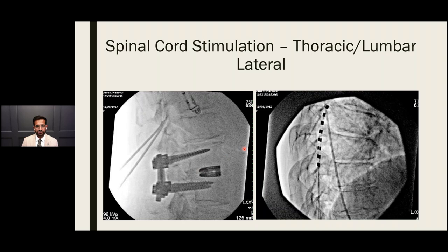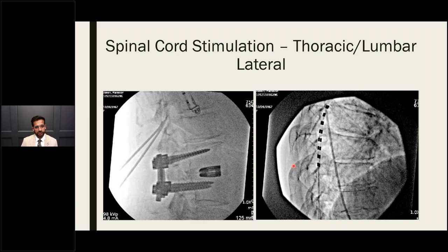In the lateral view for SCS placement, the laminar line and ventral interlaminar line are visible, with needles just past that ventral interlaminar line and leads advancing cephalad. This patient had an anterior-posterior fusion with a stimulator for persistent post-surgical pain. The ribs are not perfectly aligned, but all fluoroscopic fundamentals still apply. The key purpose of the lateral image is to ensure the leads are dorsal — on the posterior side of the neural foramen — not anterior, which would prevent activation of the dorsal columns.